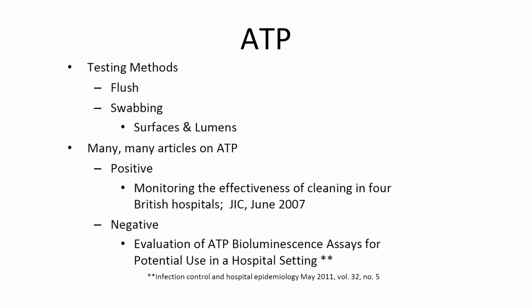Okay, now we're going to attempt to do a poll. So you'll see this question come up on your screen here. And the question is, does your department use any type of test to routinely monitor your flexible endoscope to see if it has been properly cleaned? Again, this is not culturing. This is cleaning verification. So please, if you're able, click on the yes or no button, and we'll get a poll of the attendees to see if you're currently monitoring your cleaning process.